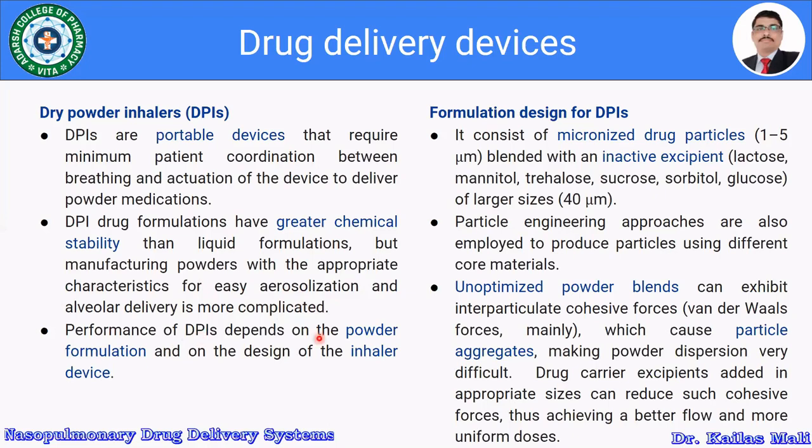Performance of DPI depends on the powder formulation and on the design of the inhaler device.